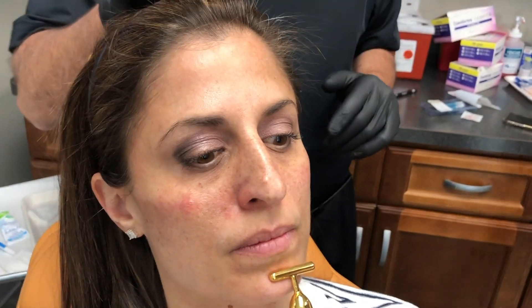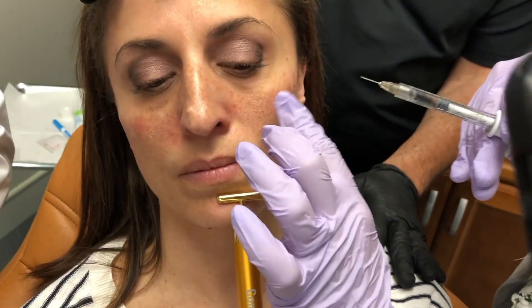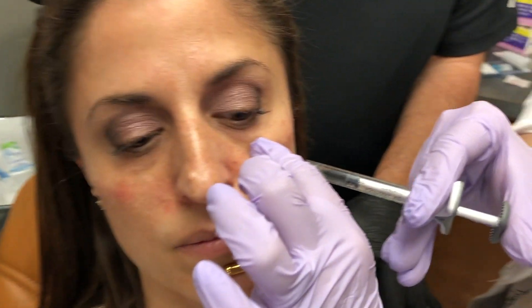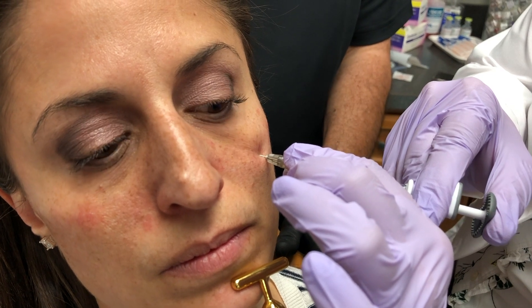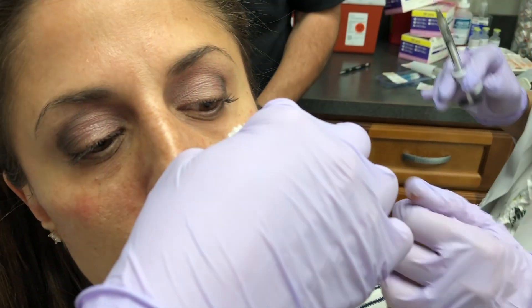You can really see that's starting to come across. Jill is looking through the camera from all different angles. She's delivering a little bit more — she knows where her infraorbital foramen is and she's staying well above it, because there are a lot of important structures that come out of that infraorbital foramen. That is looking really good.